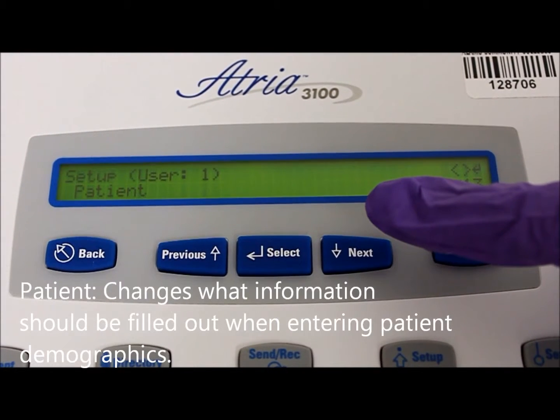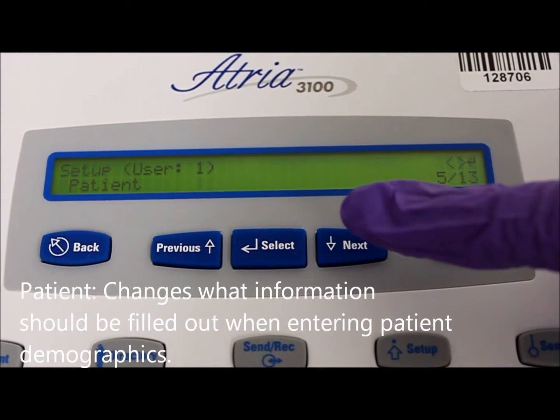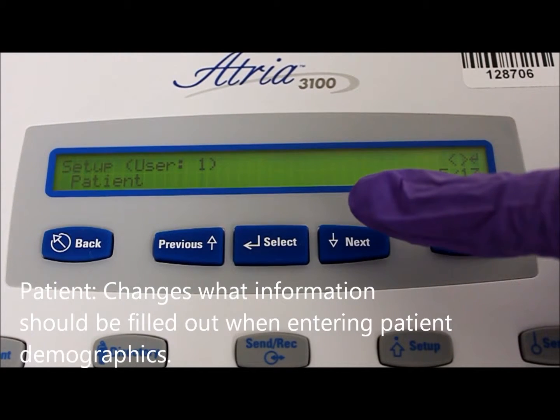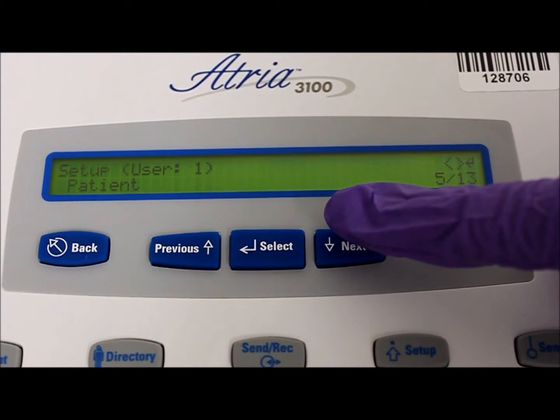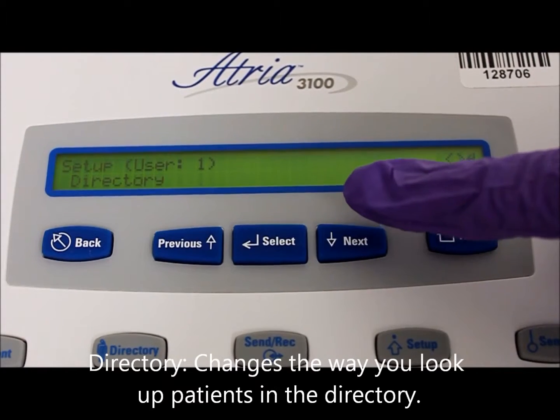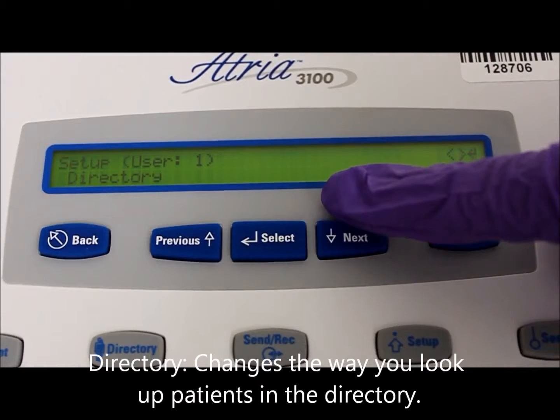The patient: this allows you to add or remove patient demographics info. You can configure last name, first name, date of birth, age, gender, race, medication, class, height, and weight. The directory: this lets you switch how to find patient information. Patient ID, name, or room can be chosen.